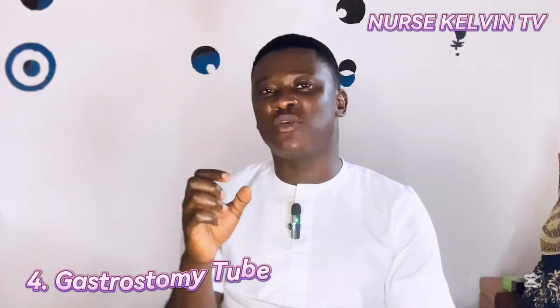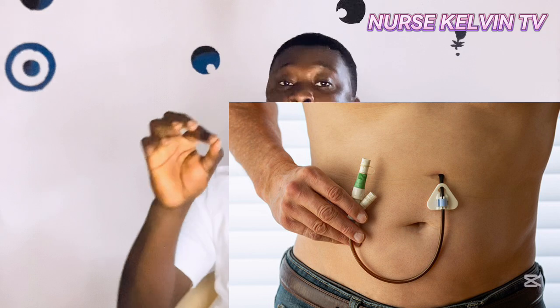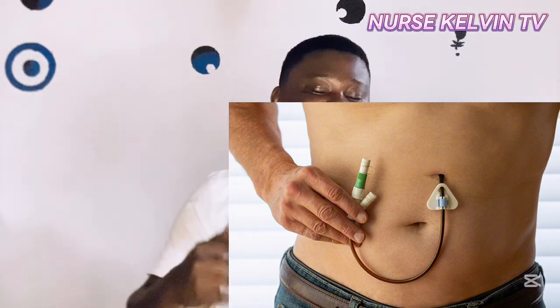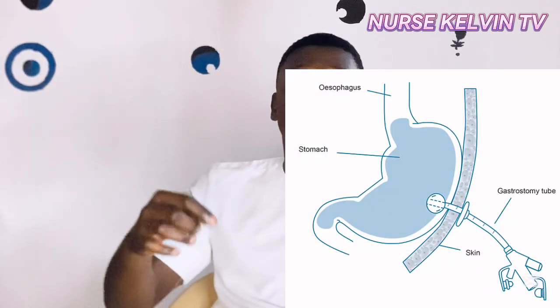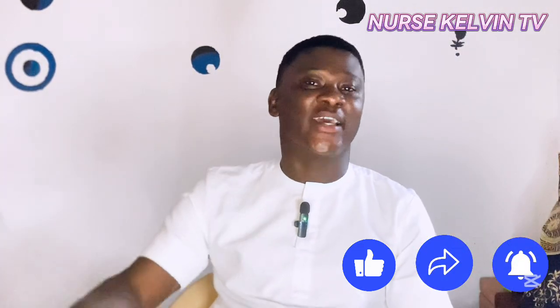Then we have a gastrostomy tube. The gastrostomy tube is used for patients who are suffering from chronic neurological disorders or severe dysphagia. So when the patient is suffering from severe dysphagia or a chronic neurological disorder, that's when we pass these tubes. This tube is inserted through the abdomen into the stomach. It's also used for long-term feeding of a patient who is unconscious or having a condition like a chronic neurological disorder.